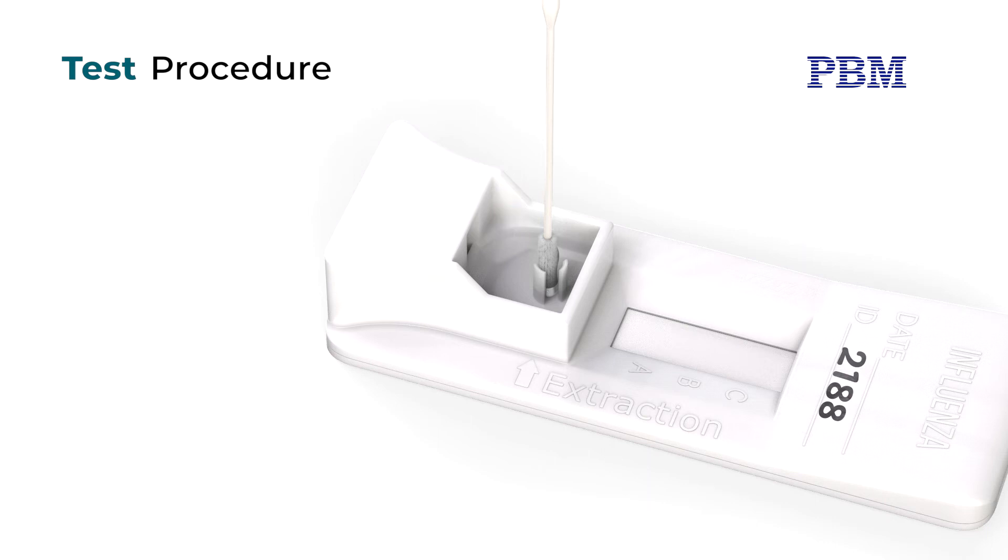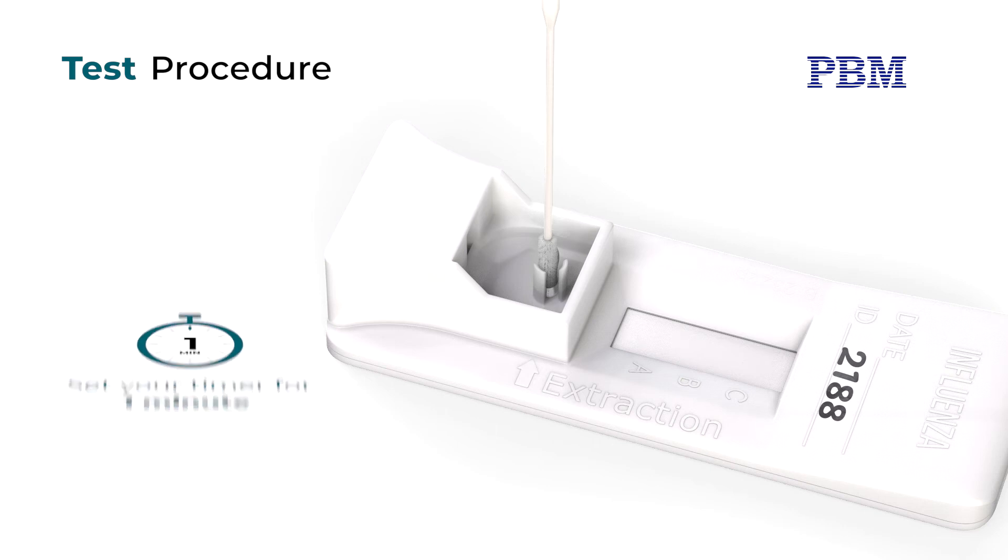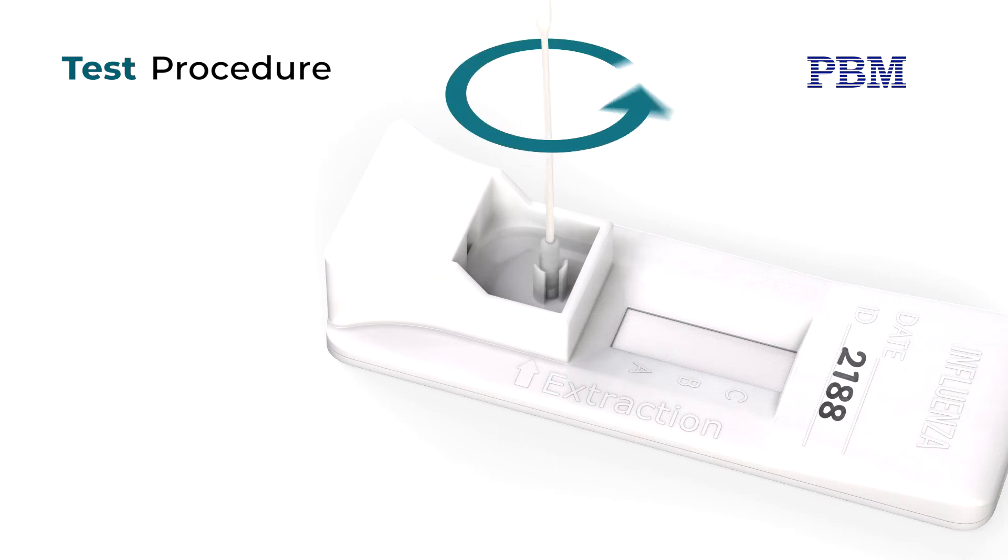Rotate the swab three times in the same direction to mix the sample. Allow the swab to stand in the device to incubate and set a timer for one minute. Then rotate the swab again three times in the same direction. Remove and discard the swab.